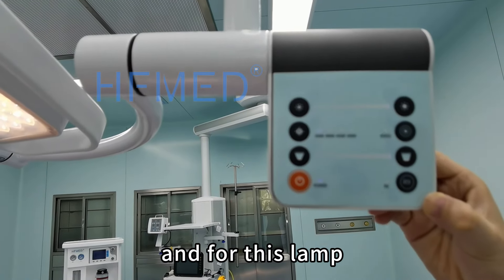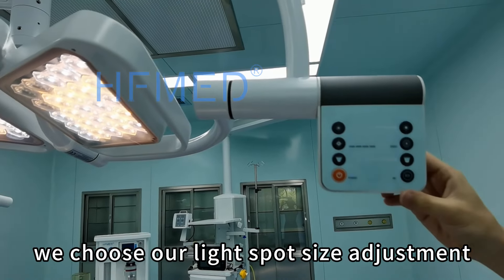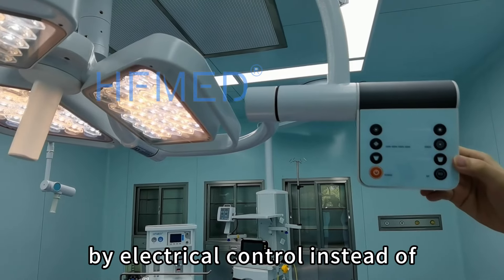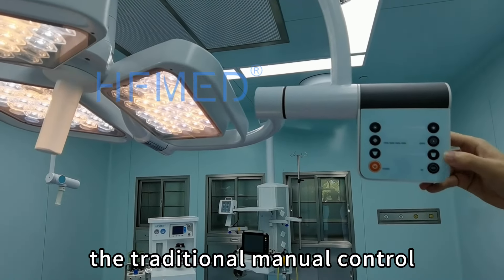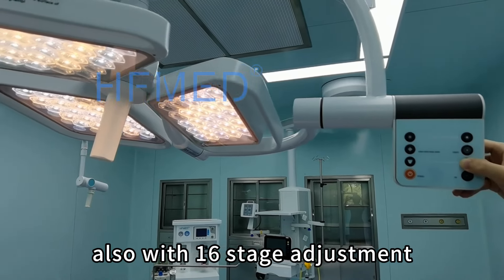For this lamp, we control the spot light size adjustment by electronic control instead of the traditional manual control, also with 16 stages of adjustment.